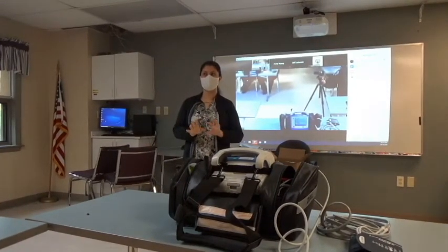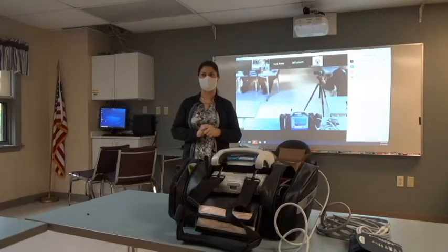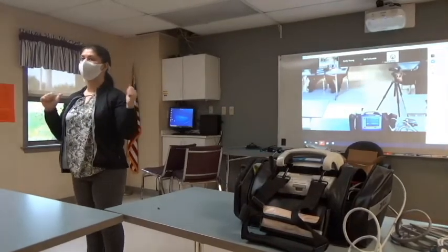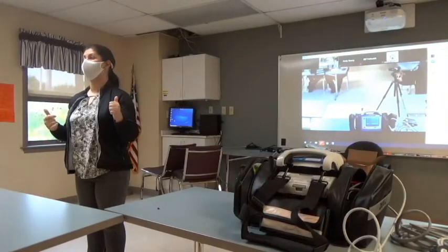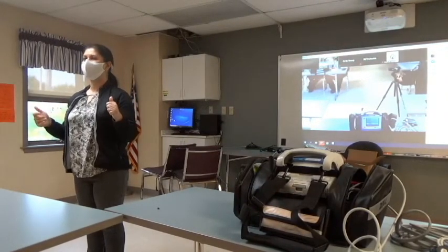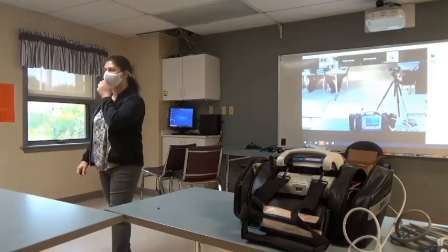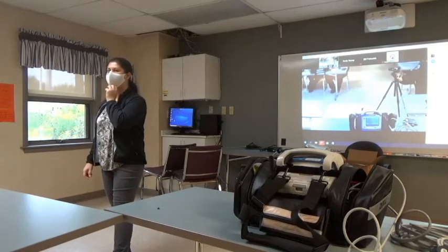Is everybody comfortable with the button pushes for cardioversion? Yes. This is the last part of the energy, and then I have CPR feedback to show you, which I have to show you off of one device. Okay, so pacing on your rhythm generator, last row, last button is a third degree heart block, if you could move down to that.